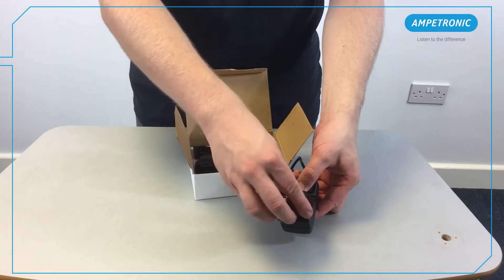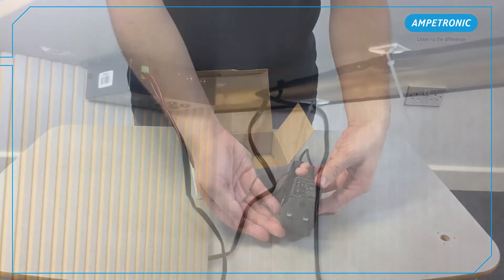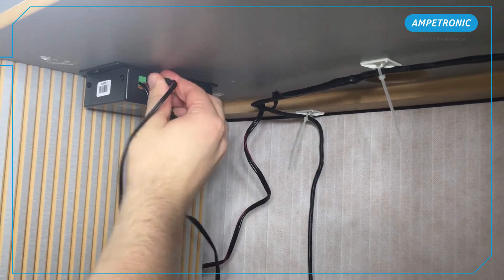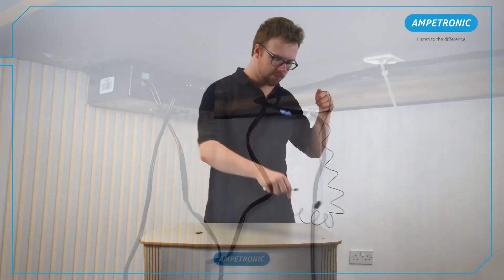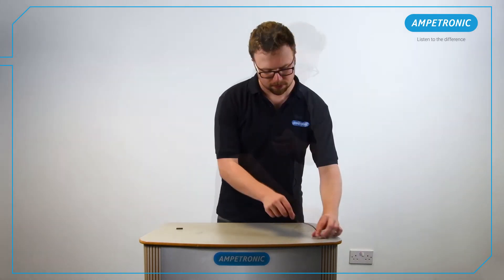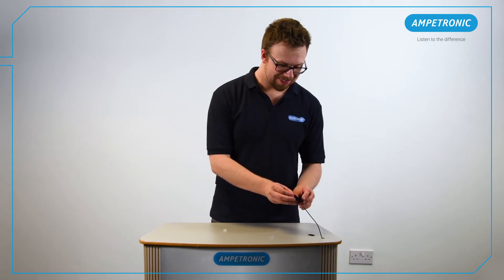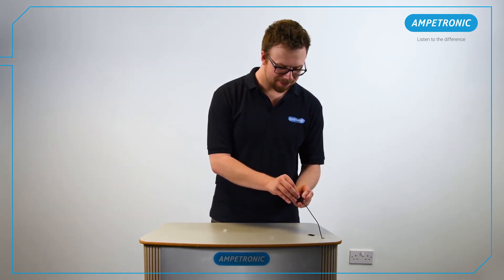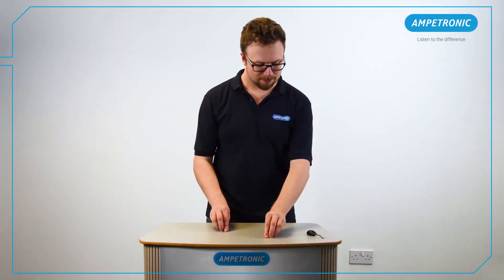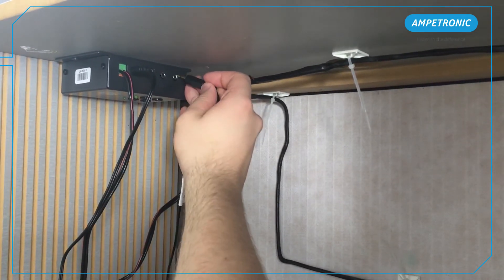Using a small flat head screwdriver, push this against the contacts on the loop connector and fit the feed cable to the loop output. Fit the correct regional plug to the power supply. Plug the power supply into a nearby socket and connect it to the amplifier. You should see the power LED light up. Feed the microphone cable down to the amplifier location and fix the microphone in place. The boundary microphones come with adhesive velcro pads. Make sure the microphone is pointing towards the staff position and close to where they would be speaking. Plug the microphone into the input one socket on the amplifier.